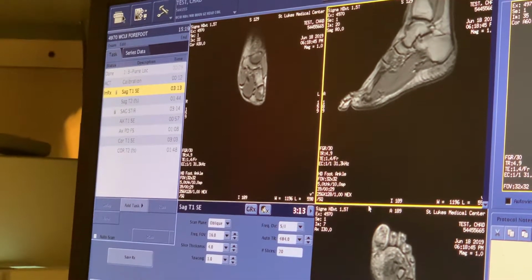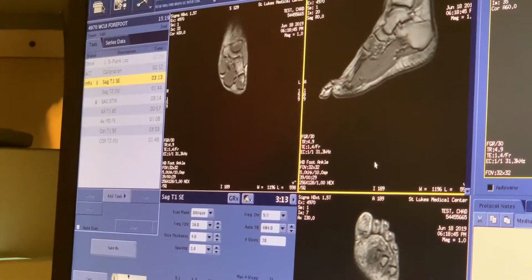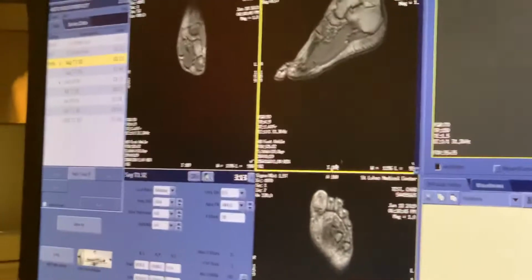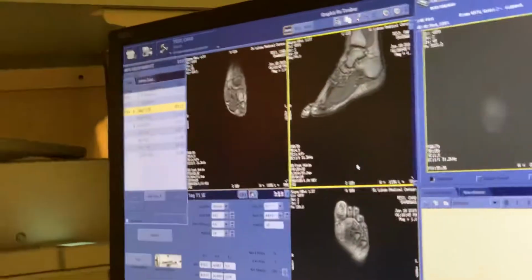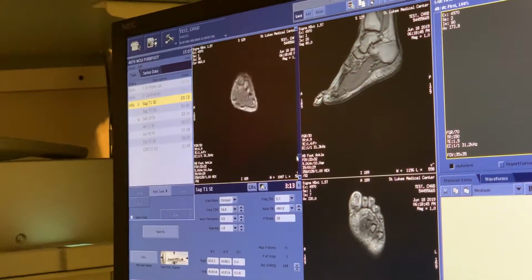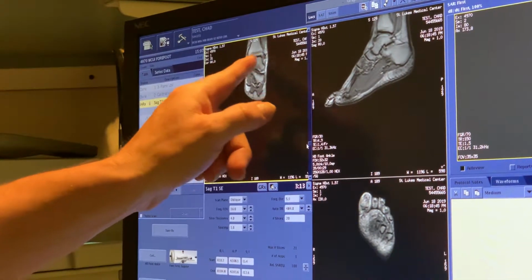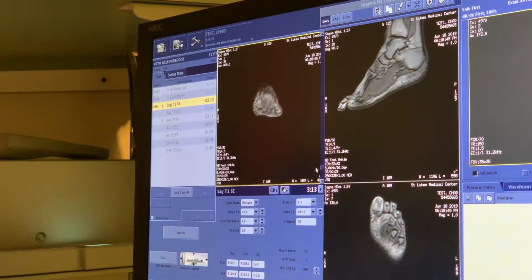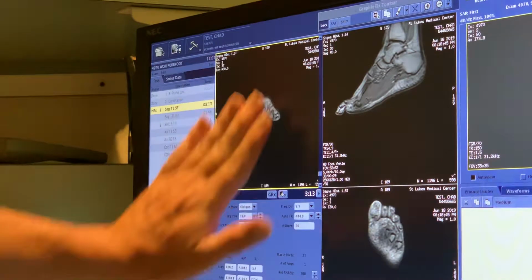And for a forefoot, the foot itself has two different planes, depending upon whether you're doing a forefoot versus a hind foot. The forefoot has an angle that angles with the arch, whereas the hind foot does not. And I'll show you what I mean by that. You see here, the hind foot, in this case, is pretty much straight up and down. There's the ankle joint. This is pretty much straight up and down. But the forefoot has an angle, I'd say something like this. It's about 30 degrees this way, what you're going to want to scan.